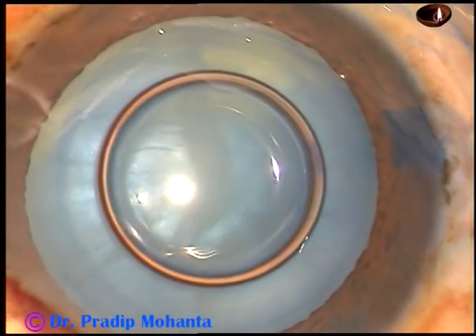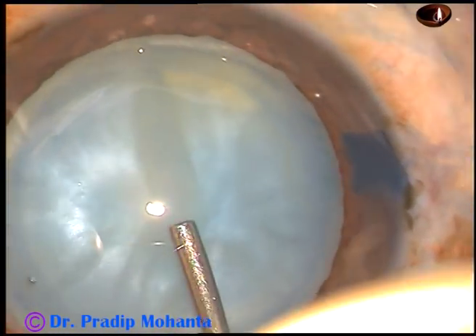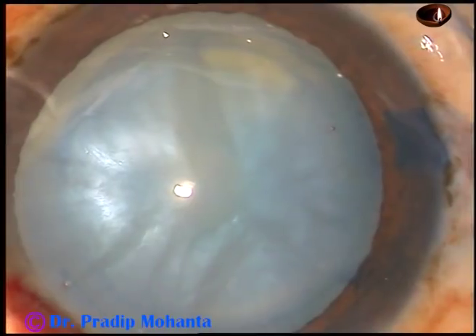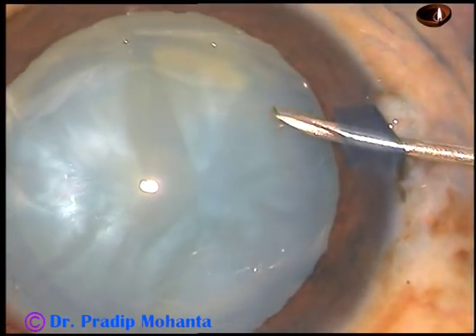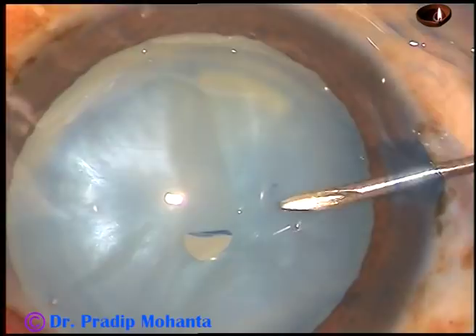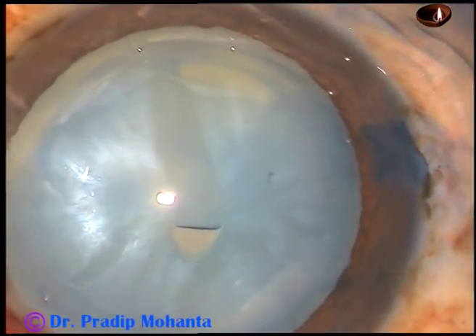And now this is 2% hydroxypropyl methyl cellulose. It is very much possible to do intumescent cataracts with only HPMC. Just make this C-flap — this is the key. Just make this C-flap.